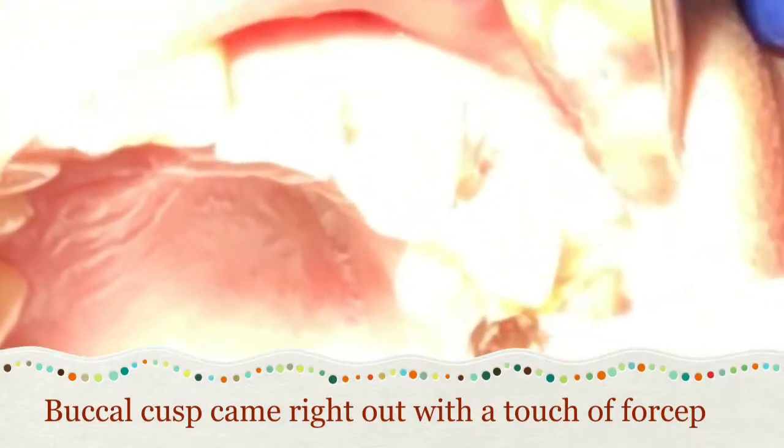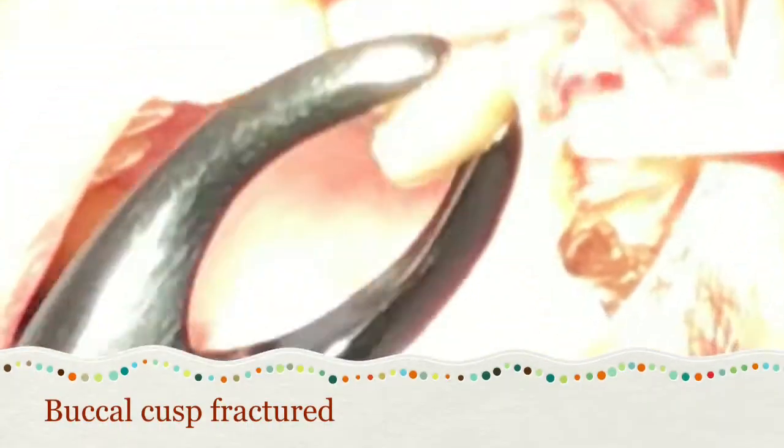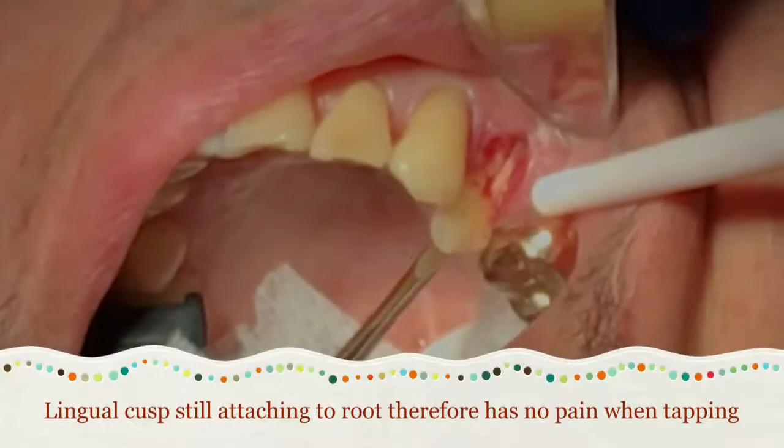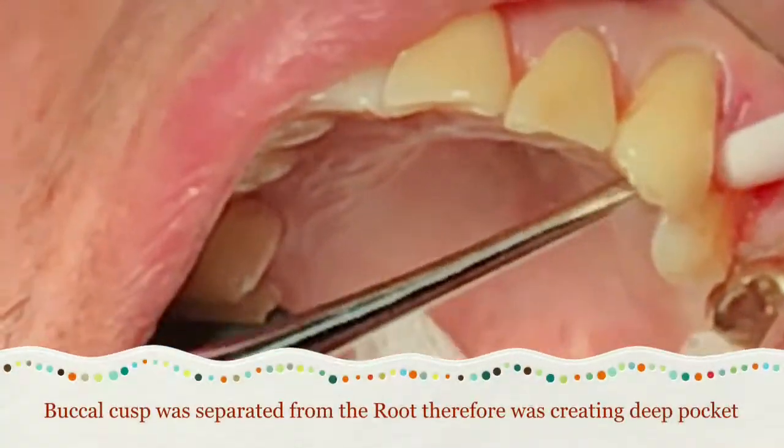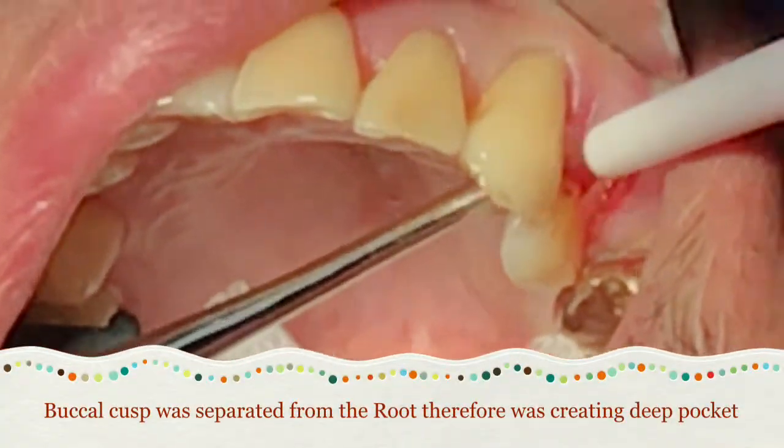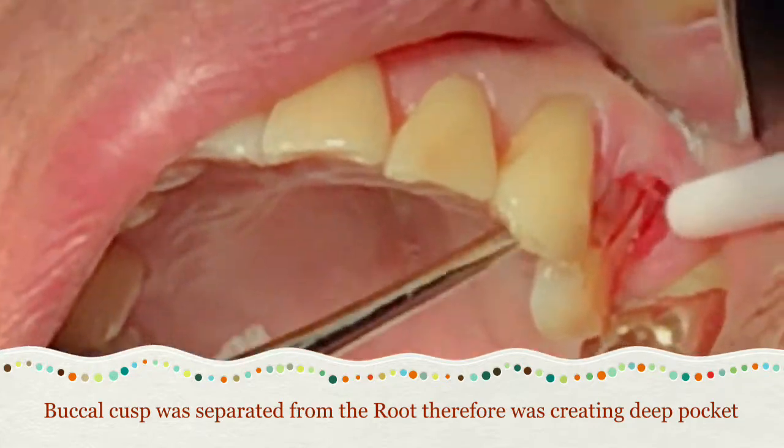As you can see, I hold the forceps, and as soon as I touched the tooth with the forceps, the buccal cusp came right out. That confirmed the determination was correct — extraction was needed.